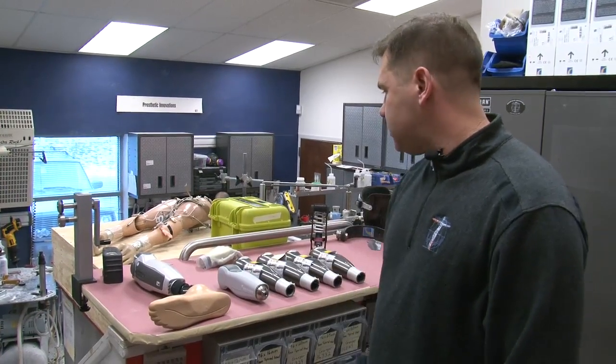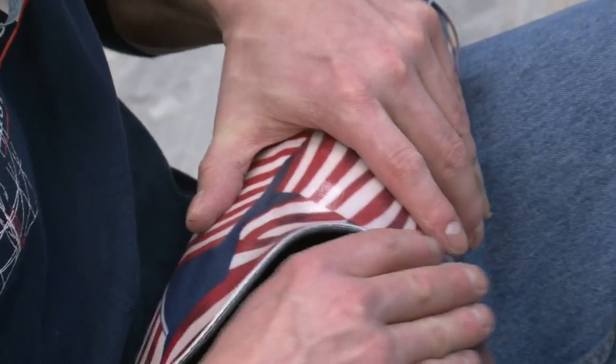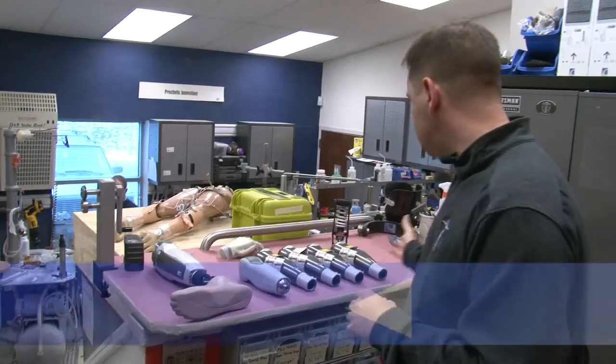This is our staging area, where we make the prosthetic socket down there, and then we assemble everything here, and then we fit it out in the clinical area.